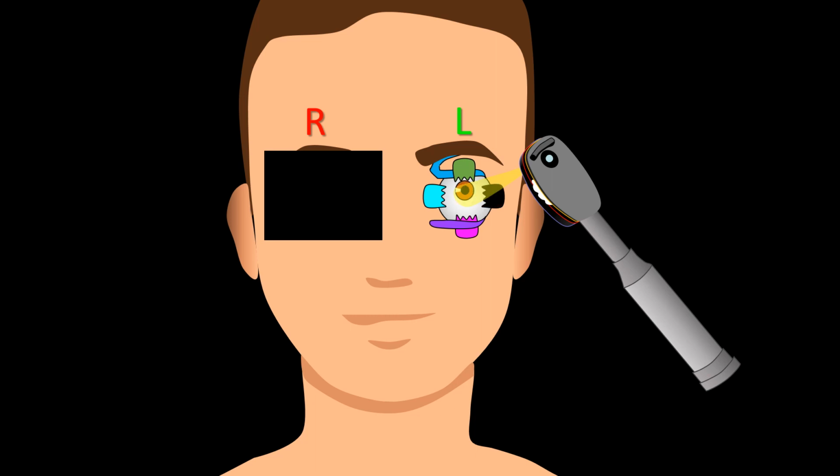Let's now look at the left retina of a patient with left lateral rectus weakness. And here you have it. Notice the relative position of the optic nerve and the macula. The macula is not in the same horizontal plane as the disc because of intorsion. The disc is at a lower plane than the fovea, as you can see in this frame.